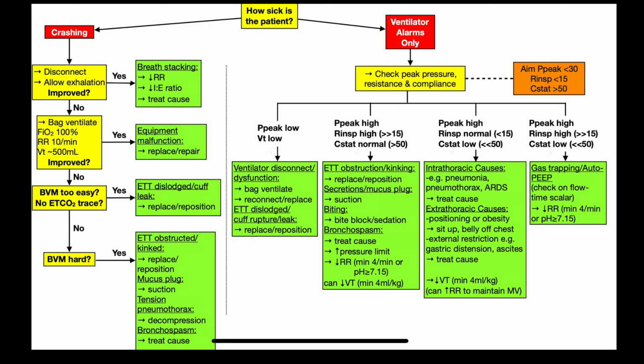Please refer to the Troubleshooting Alarms algorithm in the ALS Mechanical Ventilation Policy on Clinical Design as you study this module.